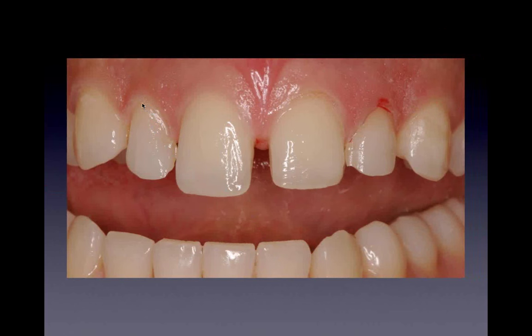So here's my final preparation. You see I've done this. I've done a little bit of surgical with the electrosurge. Look at my preparation on the lateral. It's all the way behind, right? I don't want to show any enamel forward. It's back within the lingual part of the tooth. It's almost broken open the contact because we want to bring that composite all the way to the finishing line and not have this delineation of enamel to composite. We want to bring it all lingual.